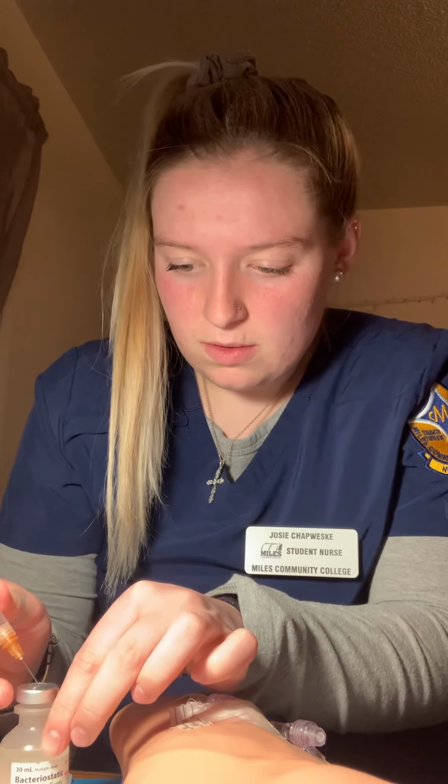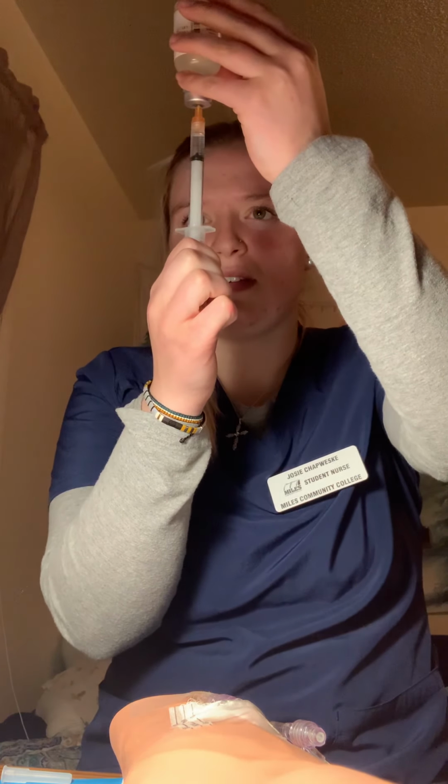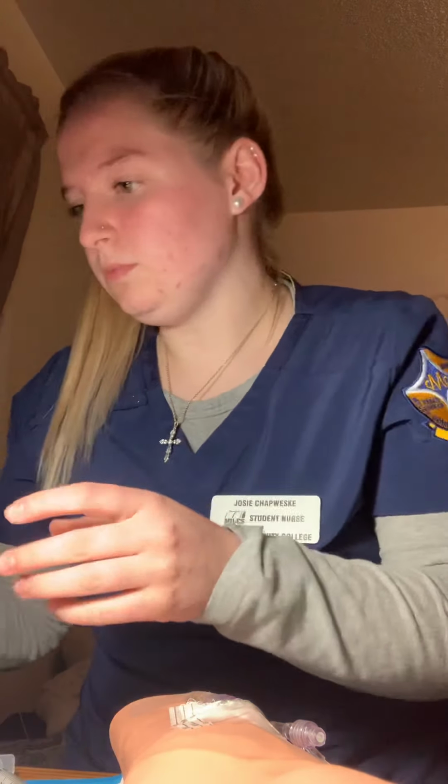So then I'll start by drawing 1.1 milliliters of air here. Inject the air and draw up the correct amount of medication. Okay. And then I'll recap my needle using the one-hand technique. There we go. So I can return that, and then I will take all this stuff into my patient's room along with a medication added label for the IV piggyback bag.